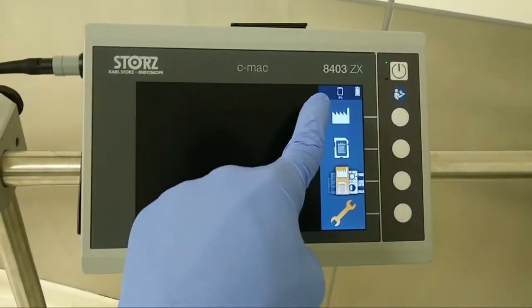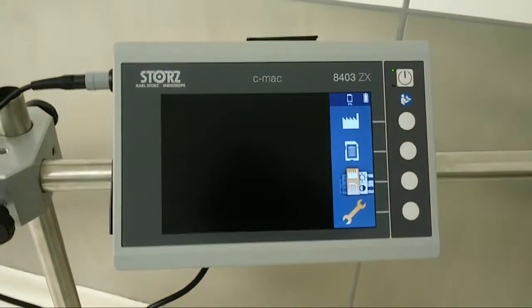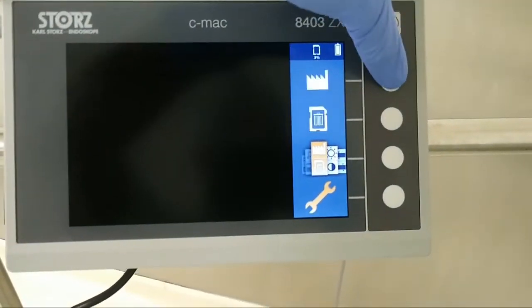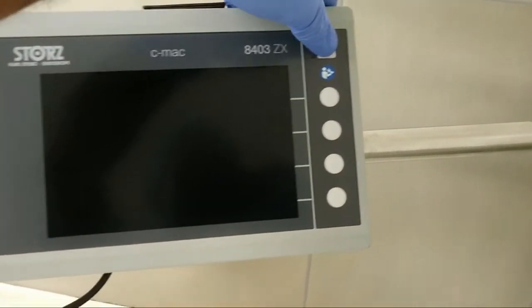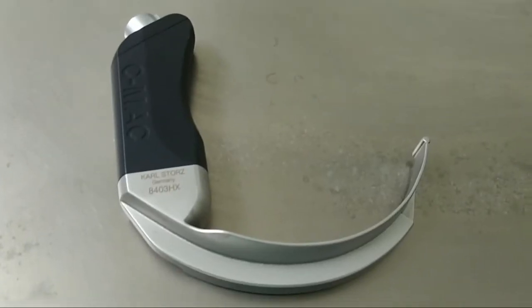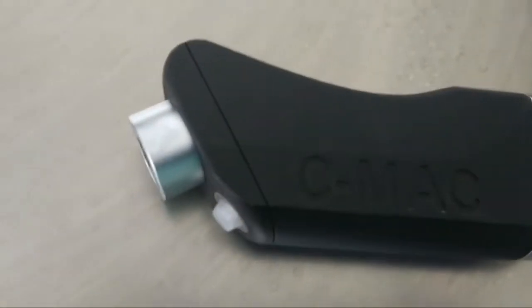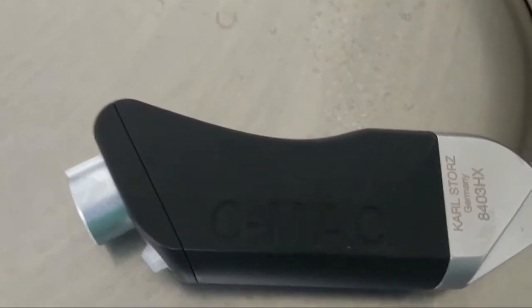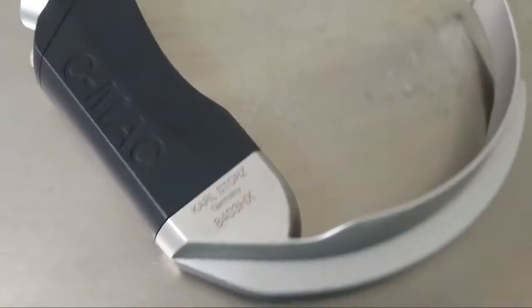This C-MAC is a good device, and its parts are the laryngoscope handle. There are two types of blades: the D blade, and 3 and 4 MAC blades, which are the ordinary type, mainly for adults. There is a monitor, and this is the laryngoscope. This is a blade handle piece, and we can attach the cable to the monitor. This is the D blade, especially for difficult intubation, short neck and short mouth opening.